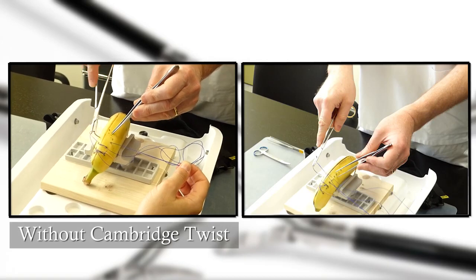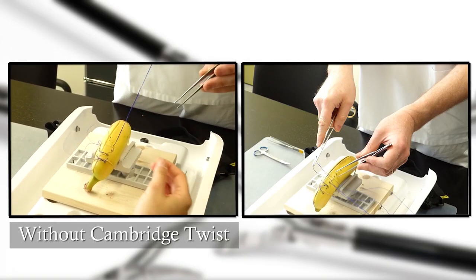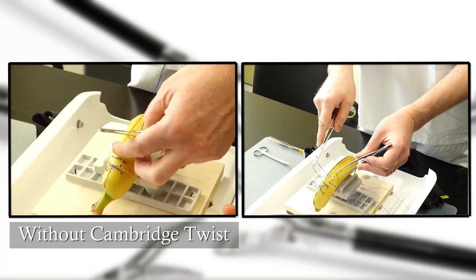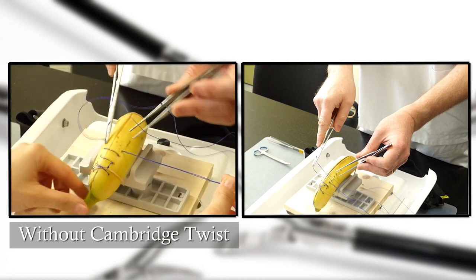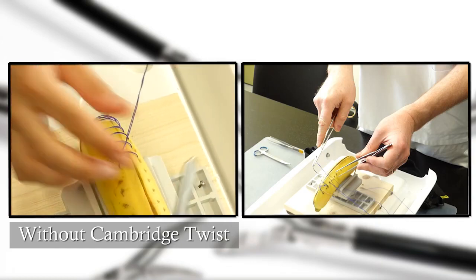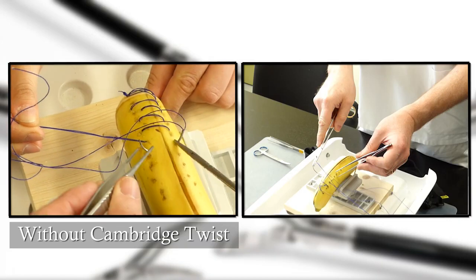Here we use a PDS-1 loop to demonstrate that without the twist, after just a few passes, the suture curls and kinks forward. The arrow shows the forcing of the tissues caused by the curled suture as it dilates the point of entry.